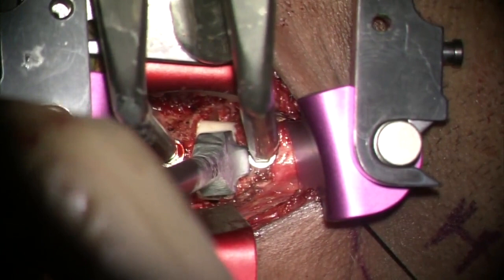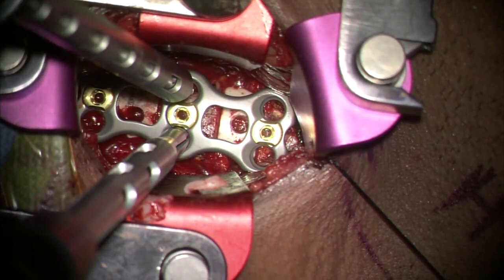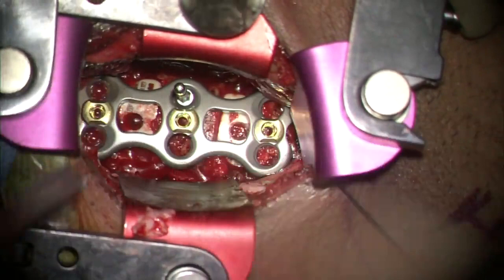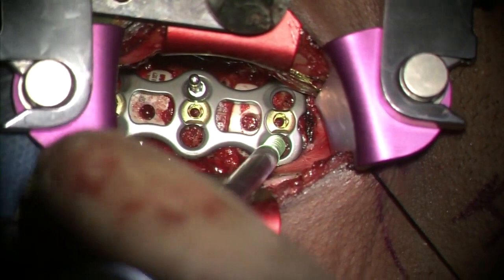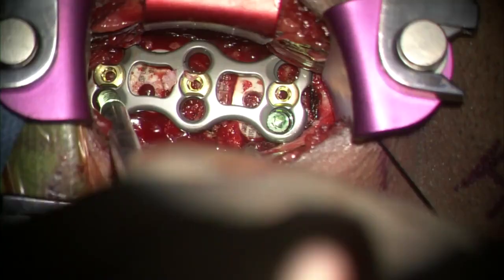The size of the plate is such that the upper and lower screw holes are just above and below their respective end plates to prevent adjacent segment disease. The required screws are placed into the plate and ultimately locked onto the plate.